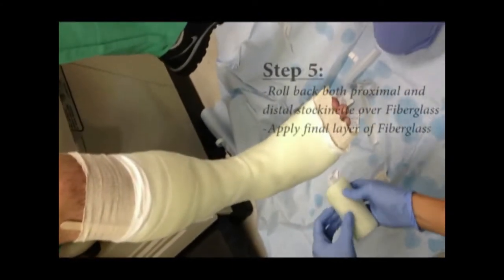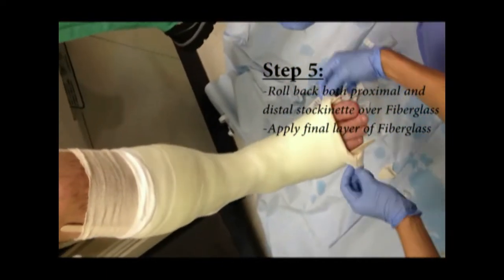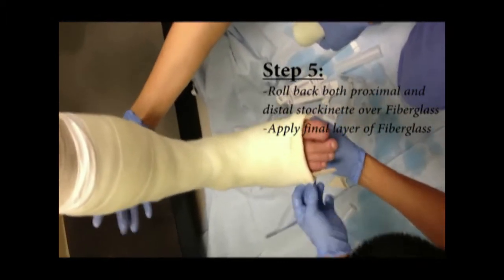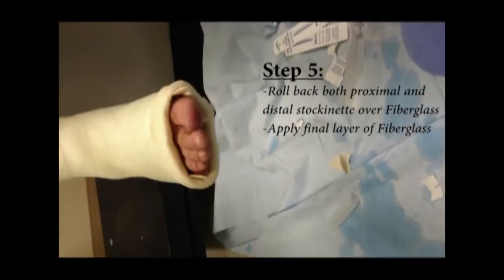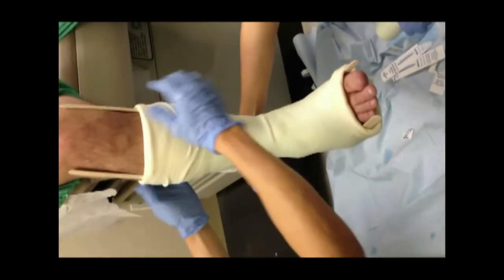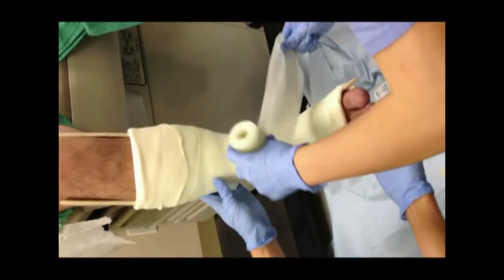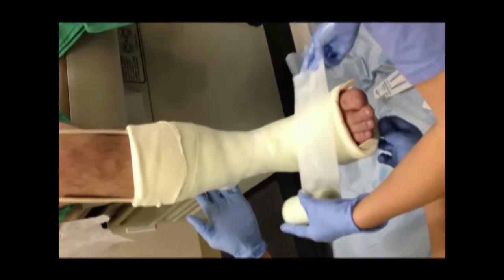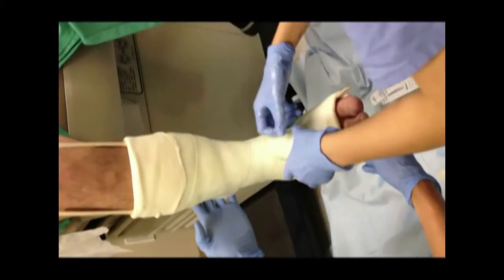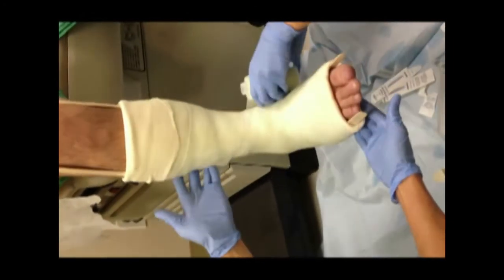This will be our final layer. The only thing we need to do here is roll back this stockinette that you've made, and then roll it down. Just go right over that stockinette. The only thing we're thinking about on this layer is making it look good, because this is what the patient will be stuck with for as long as the cast is on.